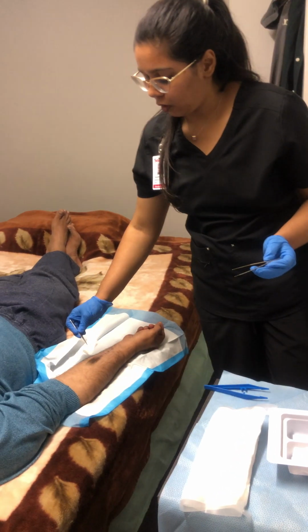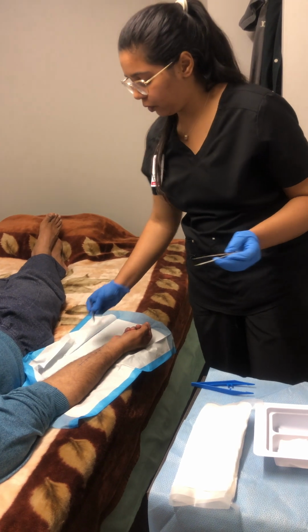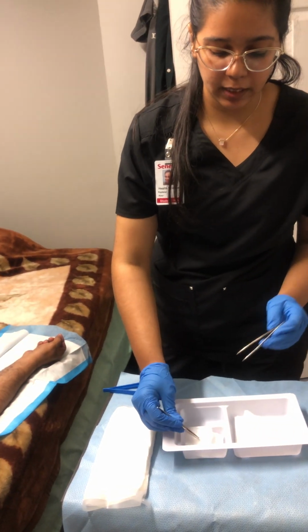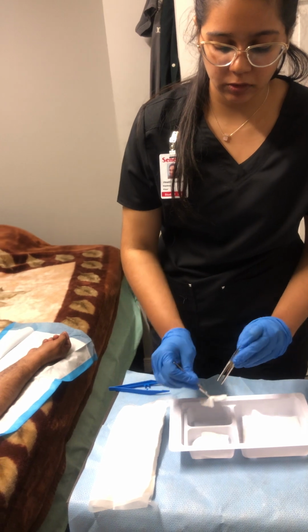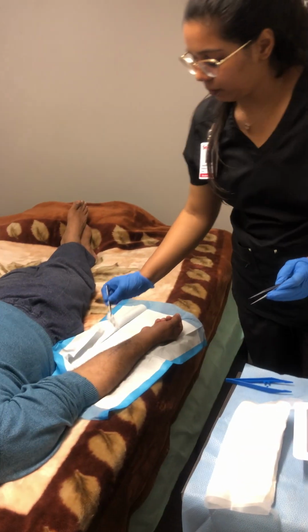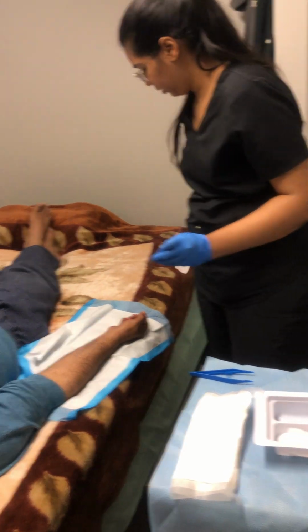We will clean from the farther side, again from head to foot end. Discard it in the garbage bin. Take another swab. We will dip it in the saline solution and squeeze it. Clean from the nearest side, from head to toe end.